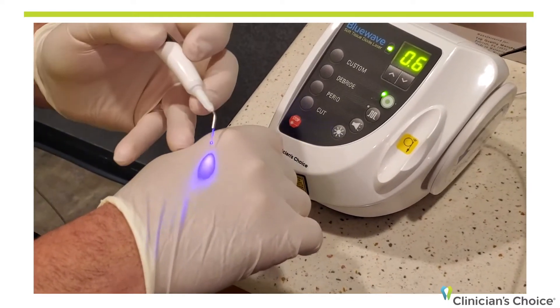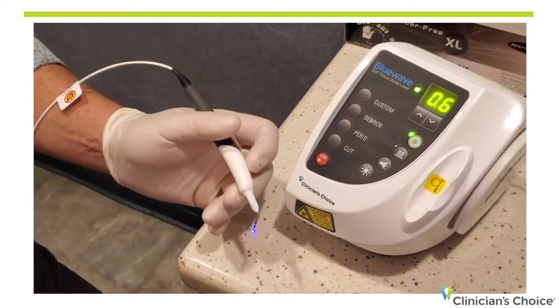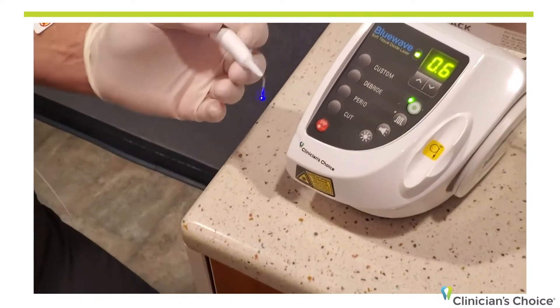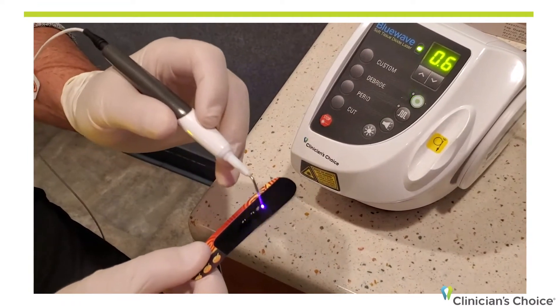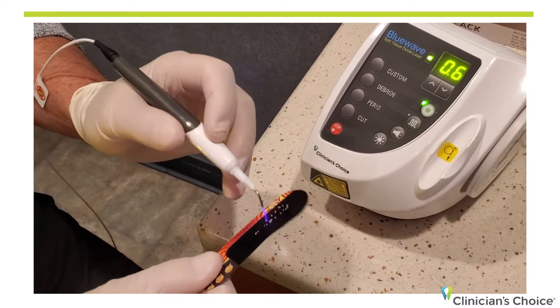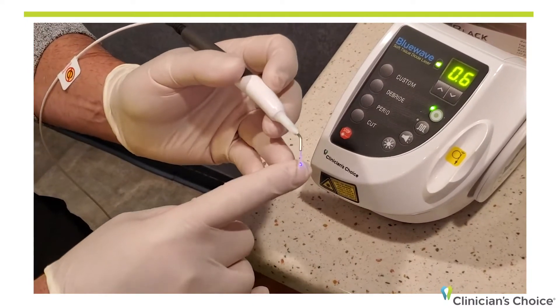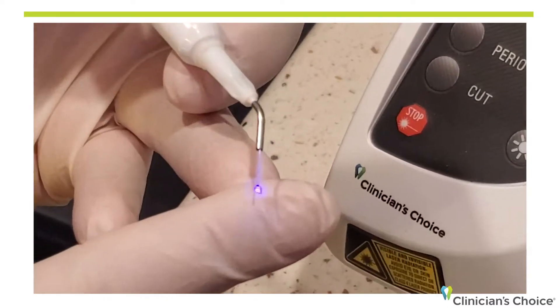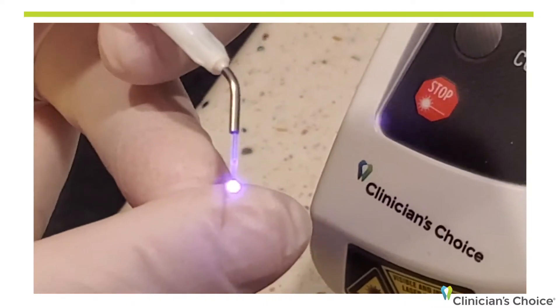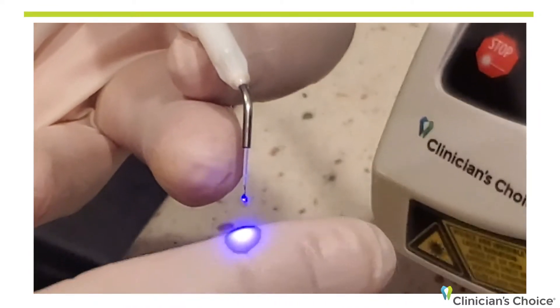Diodes in general — the tips do not come out of the box ready to cut. You have to what's called initiate the tip. I'm going to fire the tip into a piece of articulating paper a number of times, just like that. I'm at six tenths of a watt, very very low energy. What happens now is that tip becomes dark, and that dark tip means it's ready to cut. You'll see if I step on the pedal that that tip has a nice glow to it now, and that tip is ready to cut.